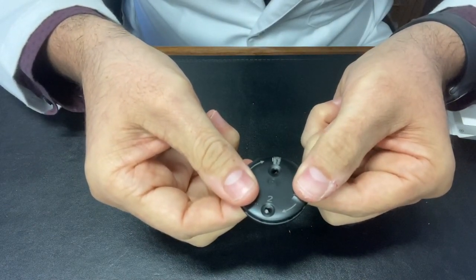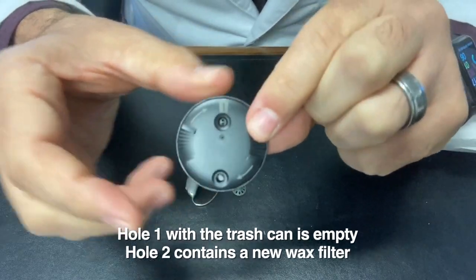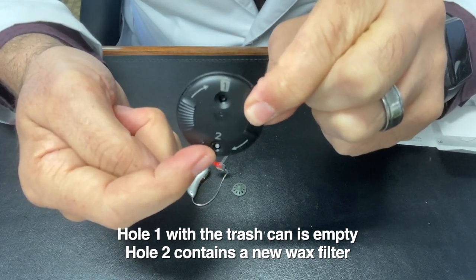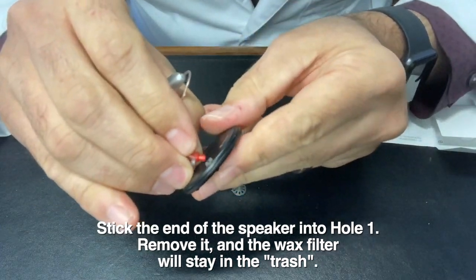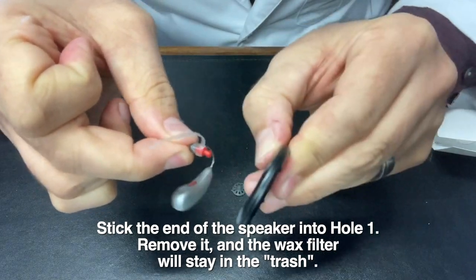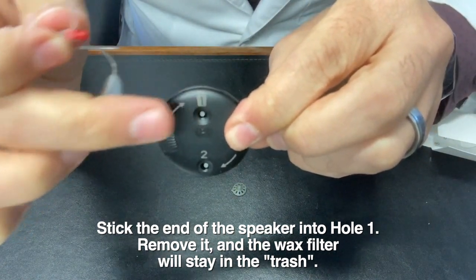I like to put my fingers on the underneath and my thumbs right here, and then you can kind of turn this a little bit. You can see these arrows are prompting you to turn it in this direction — the bottom stays stationary but with your thumbs you can turn it. When I turned it a little bit, you see that one, the trash can is empty, and two, the non-trash can has a new little white piece in there — that's our new wax filter. We're going to take our device and stick the end of that, the speaker, directly into number one where the trash can is, and just push that in there. Remove it — you'll hear it click when it goes in — and now you can see that you've actually deposited the wax filter. The wax filter is no longer in the end of the speaker; it's in that number one trash can compartment.